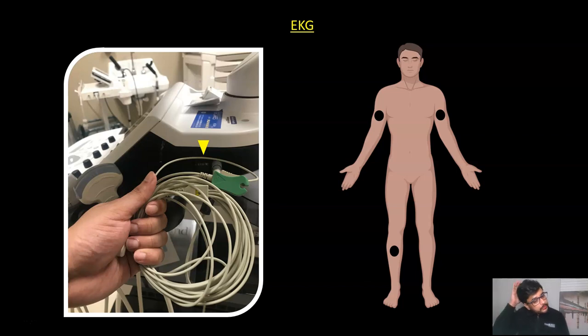And because we are assessing blood flow patterns, and blood flow patterns occur during systole and diastole, it's important to identify the phases of the cardiac cycle accurately. For that, having a simultaneous EKG helps. And when I say EKG, I'm talking about the EKG that's connected to the ultrasound machine. This is the ultrasound machine here. Usually it has a slot for the EKG cables, and these EKG cables are usable with the ultrasound machine only. And you just need to connect the limb leads, so right upper extremity, left upper extremity, and right lower extremity, and you're good to go. You're going to get a tracing on the ultrasound screen.